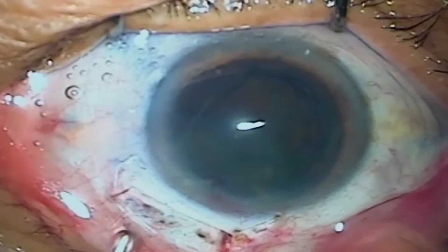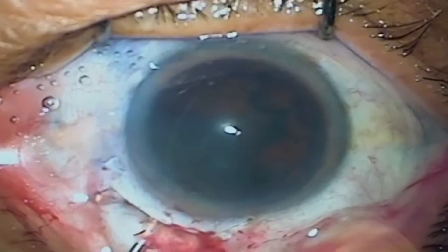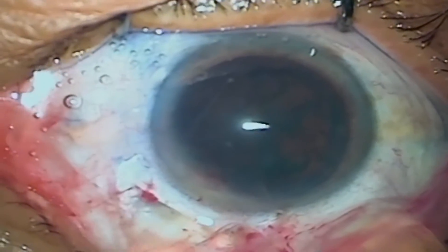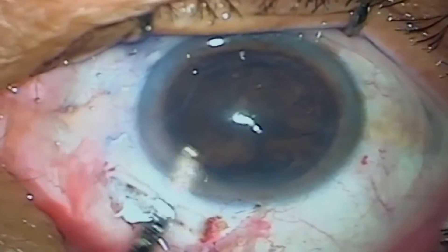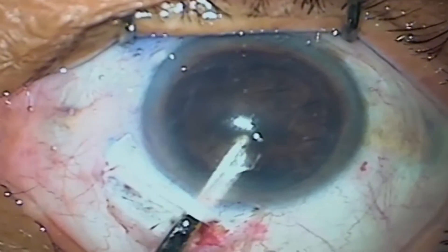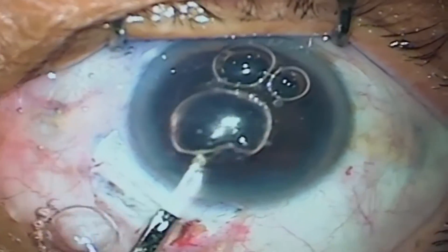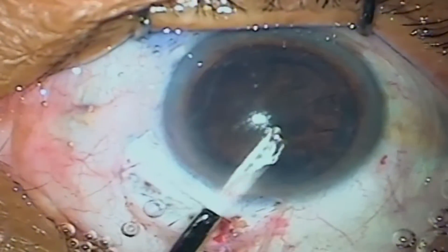Do not leave even a single chunk of cortex in the bag — cortical remnants are a big source of reaction and corneal edema in initial cases. If you take care of these points, manual SICS is an artist's surgery with excellent outcomes which are very predictable and will give you equivalent results on day one.